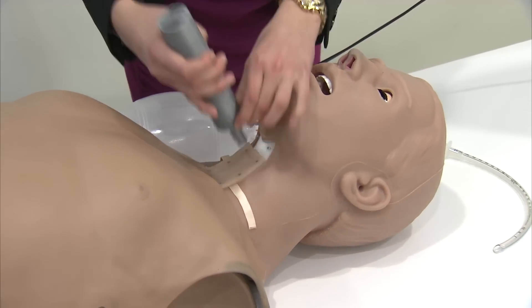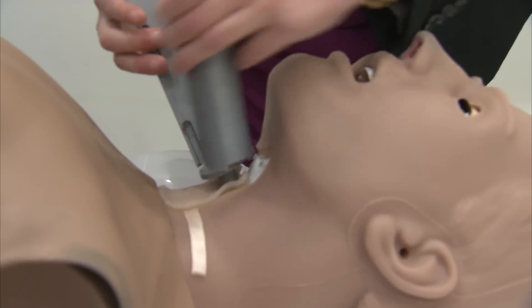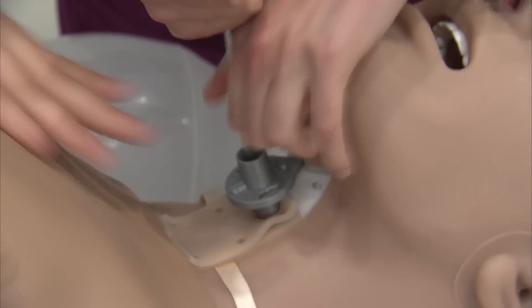Afterwards, she inserts the tip of the Crick Spike into the stoma that she's created, then breaks off the removable handle. And finally, she inserts a breathing tube through the Crick Spike tip.